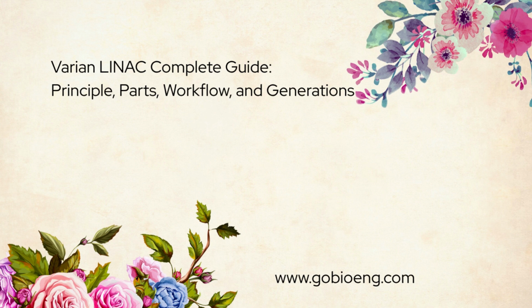For radiographers, the LINAC is a setup, imaging, and treatment delivery system. Their work includes patient positioning, immobilization, image acquisition, image matching, couch shifts, treatment delivery, patient observation, and communication with the wider clinical team. Radiographers work closely with patients during treatment. They need the machine to be reliable, understandable, and safe to operate.